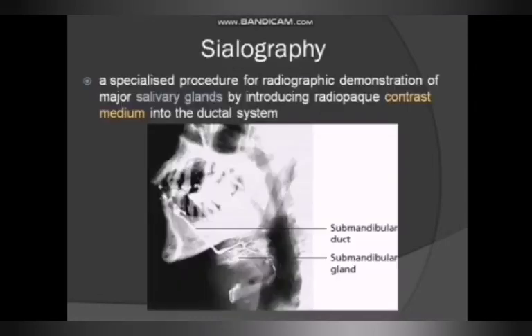Now, let's talk about sialography. What is sialography? It's a specialized procedure for radiographic demonstration of the major salivary glands by introducing radio-opaque contrast medium into the ductal system. Like this picture showing the normal sialographic view of the submandibular gland.